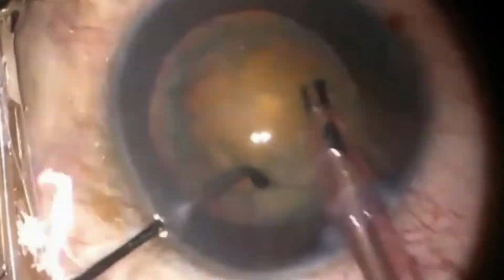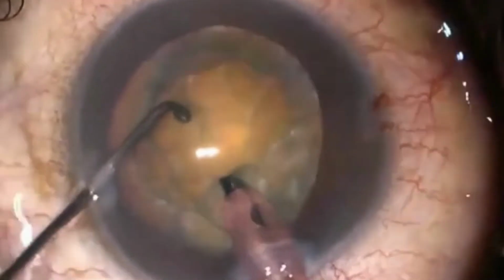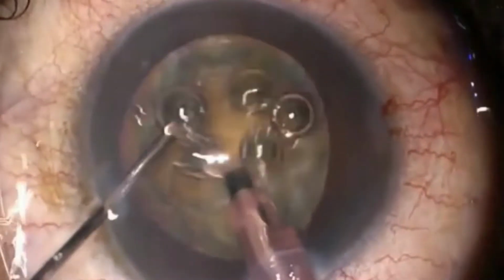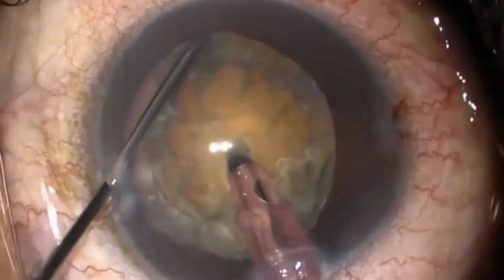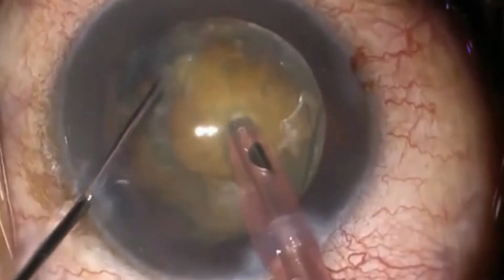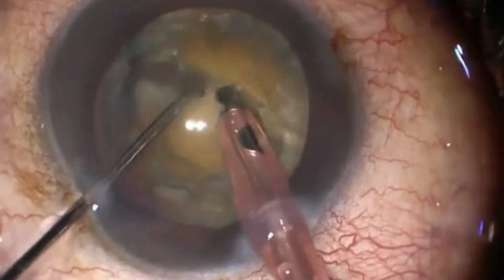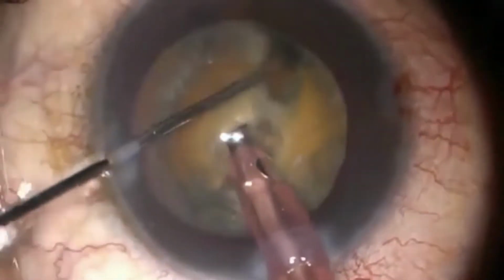Horizontal Phaco chop. With horizontal Phaco chop techniques, the nucleus is divided into two fragments using a chopper moving in the horizontal plane. After being placed at the lens equator under the anterior capsule, the chopper moves toward the Phaco tip, which has been impaled in the center of the nucleus. When the chopper reaches the Phaco tip, both instruments are moved apart, leading to mechanical division of the nucleus.